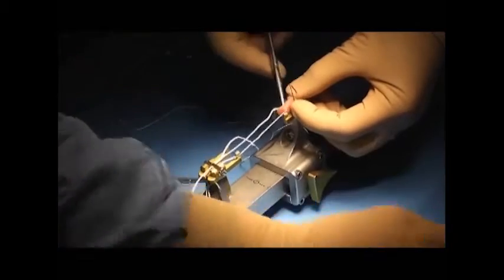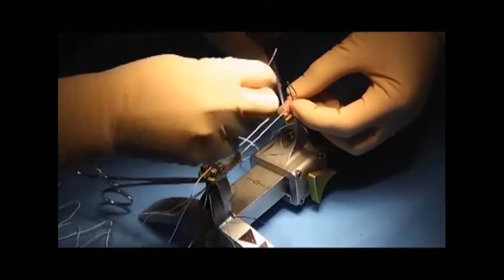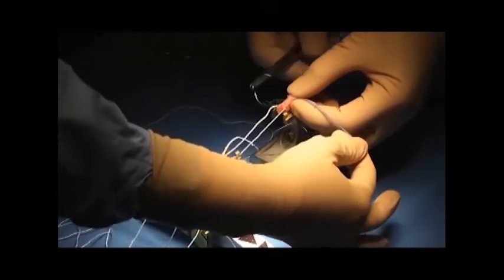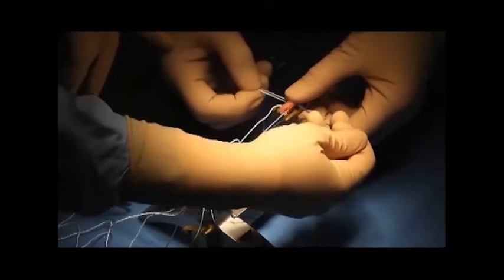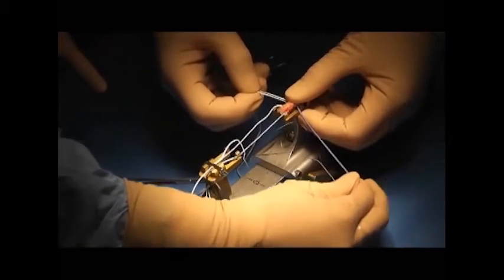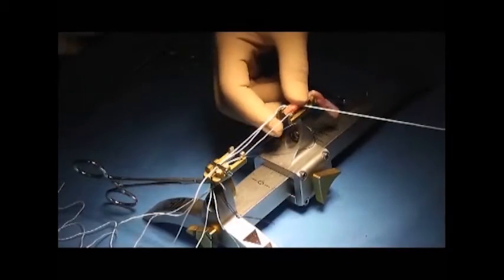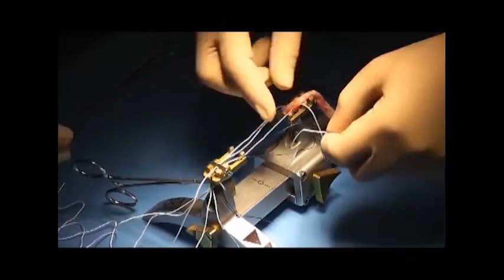Repeat the same instructions by passing the other white braided suture in the opposite direction through the hole located near the tendon bone block interface. Pass the end of the white braided suture through the opposite temporary black loop and make a fold.